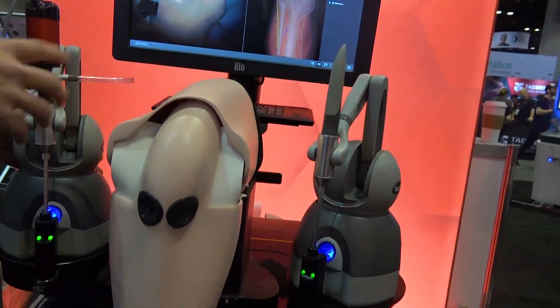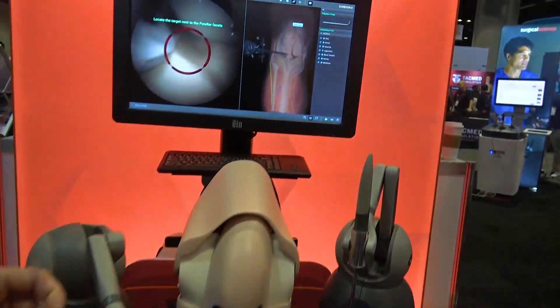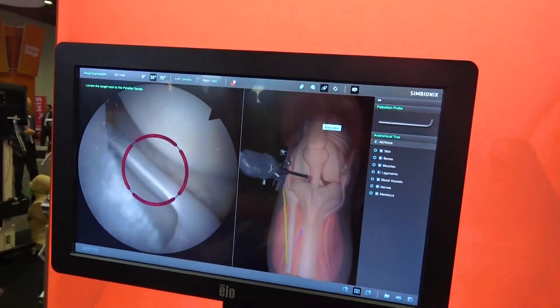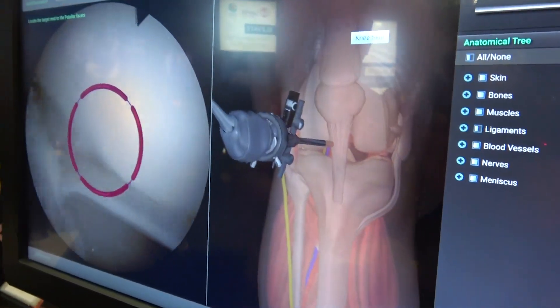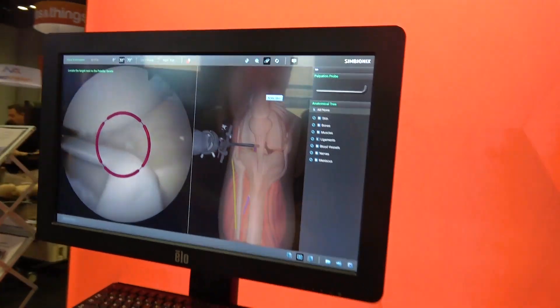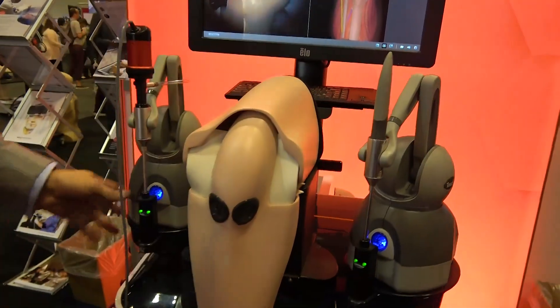We use various instruments including a camera. Doctors can go with a camera inside the patient and look for problems or perform tasks like anatomical recognition. They can use instruments to treat the problems — that's the ArthroMentor.